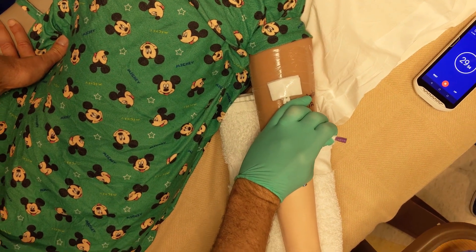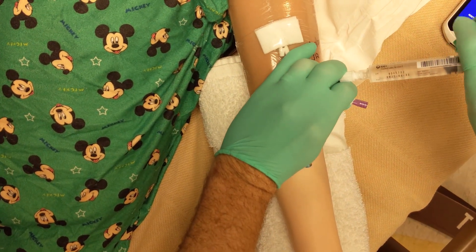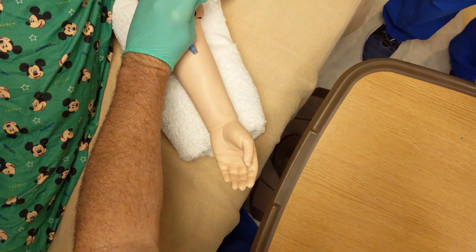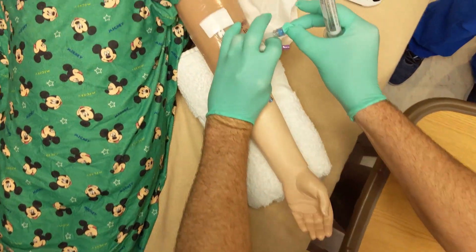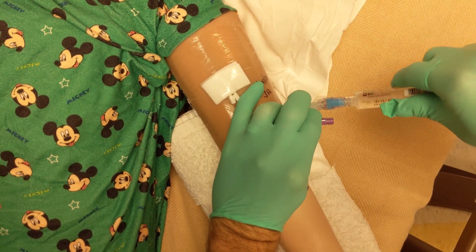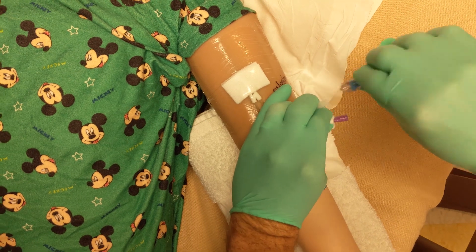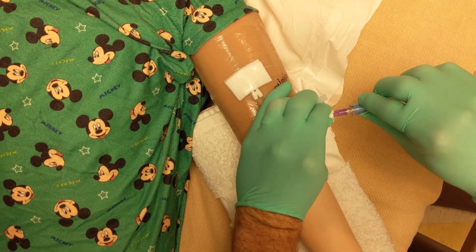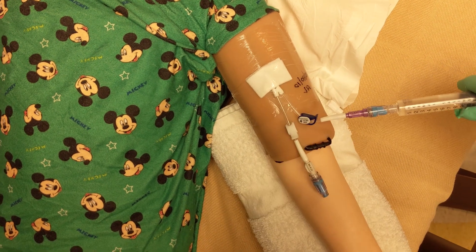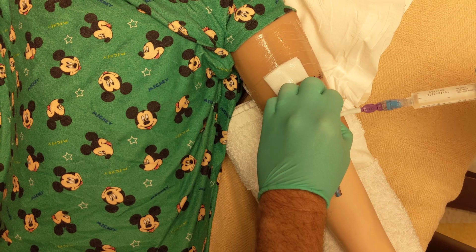Then have the person helping you open a sterile flush. Grab the flush without touching the outside of the package and remove the cap using your other hand. Grab the new cap from a sterile package that your helper has opened for you. Attach the flush and prime the cap. Attach the new cap to the line and then flush the line. Check for blood return if you would like.